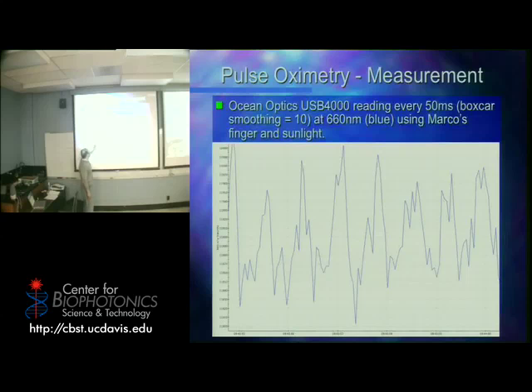So in 5 seconds I had 1 beat, 2 beats, 3 beats, 4, 5, 6, 7. So that means my heart rate was, you guys figure that out? What was my heart rate? This was 5 seconds. I had 7 changes. What do you guys think? Does that sound right? Okay. There's 12 5-second increments in a minute. So 12 times 7, 84. So my heart rate was 84.